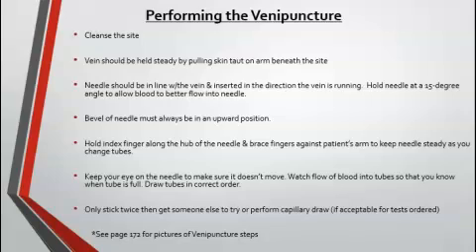You want to hold the needle at a 15-degree angle to allow blood flow into the needle. The bevel of the needle should always be pointed upward, and we'll see exactly what the bevel of the needle looks like in one of the next slides.